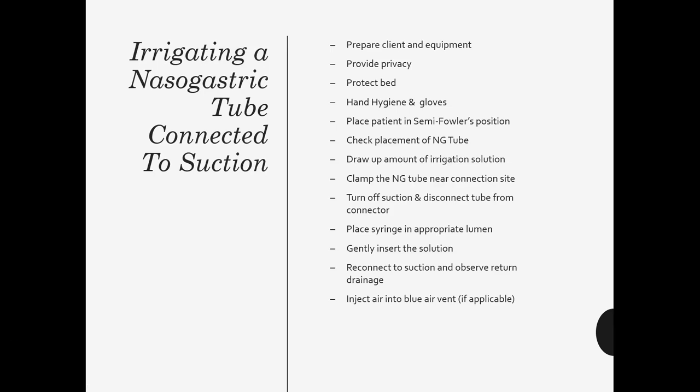So it's important to irrigate a nasogastric tube to make sure it's staying patent and not getting any clogs in it. But specifically, we're going to talk about irrigating when it's connected to suction.